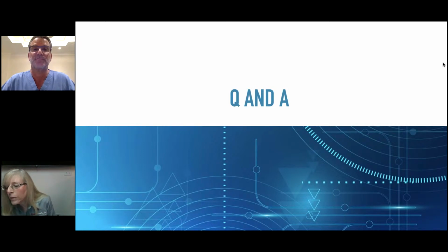Speaking about that, you mentioned cut back 0.5 to 1 millimeter of apical portion of gutta percha. Can we just use a gutta percha that has a good tug back 0.5 to 1 millimeter short of working length? Sure. I mean, if you're cleaning your root canal and debriding it adequately, and you're 0.5 millimeter short or 1 millimeter short, I could live with that.